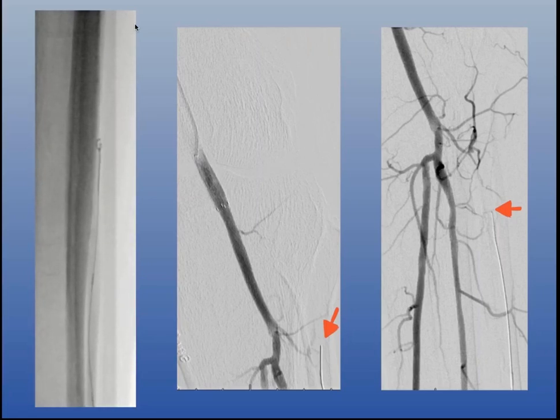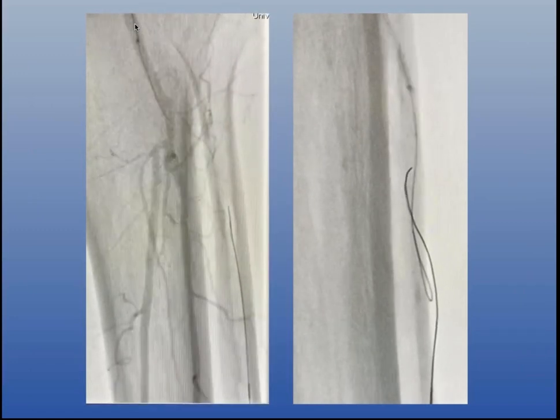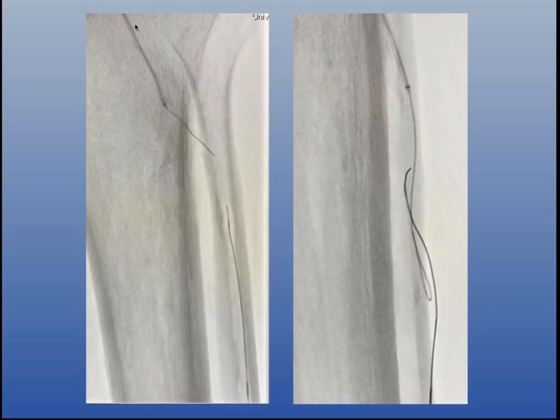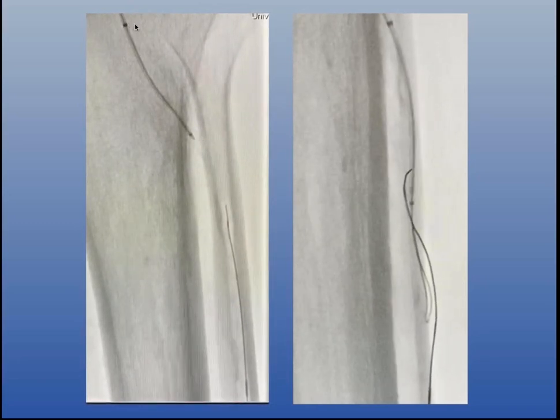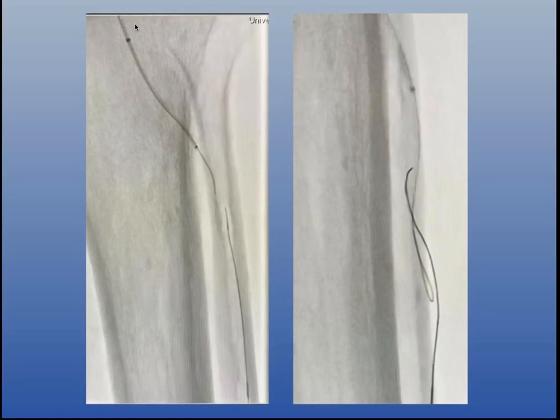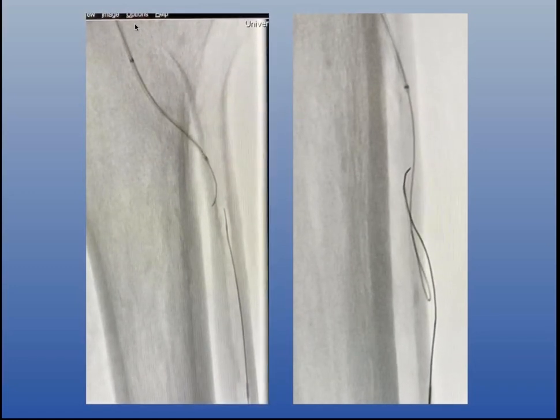And so what did I do? I pulled the system back, and then I decided, let me try from above, because I have to meet somewhere in the middle, right? So you can see now I've got a catheter. I've got again an 018 guide wire in this case that I'm using to basically get into that proximal cap. And then you can see that I'm trying to get my catheter and guide wire near that other one, and clearly I'm in two different subintimal planes.